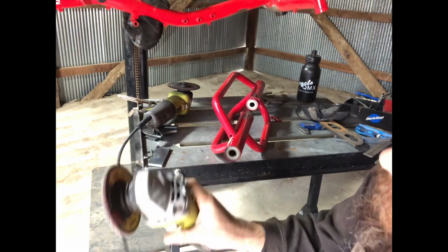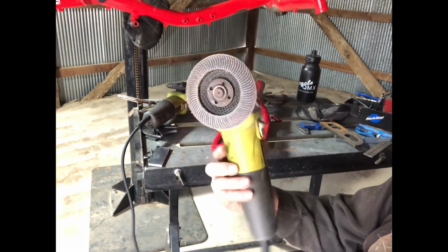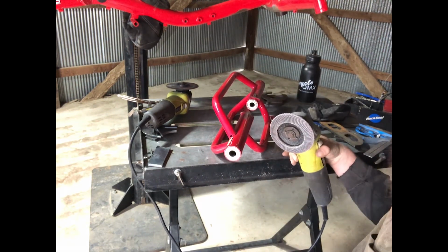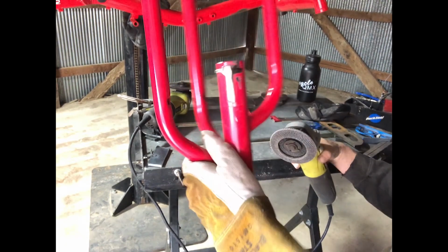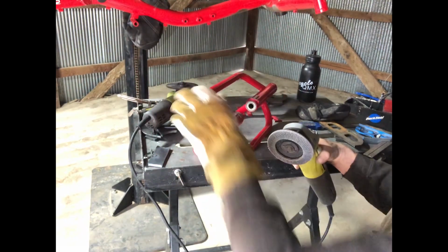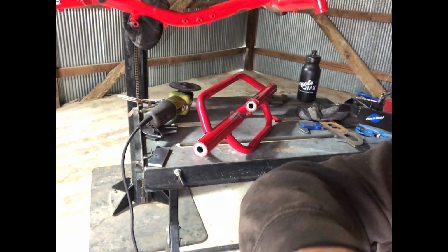In case you're wondering, I'm using a 60 grit DeWalt paddle sander. Cuts down through the material real quick without actually having to put a grinding wheel on it, and still leaves a relatively smooth surface, perfect for welding. Also removes any kind of paint, anything like that. Makes quick work of it. So let's go ahead and finish this side, and I'll go ahead and do the other side.